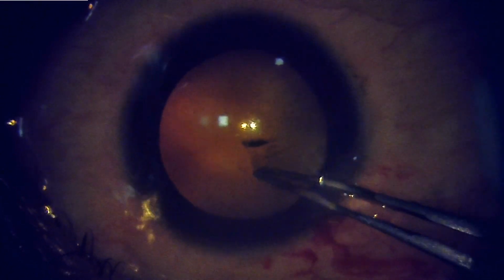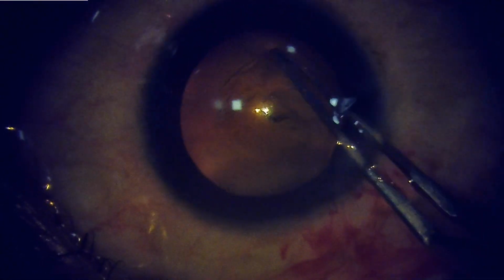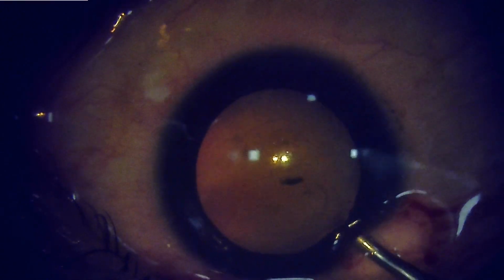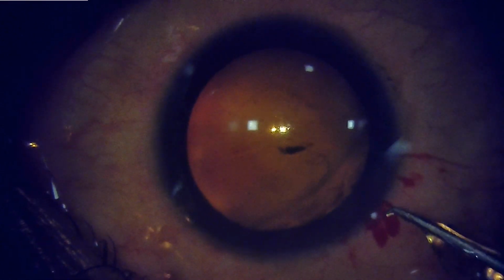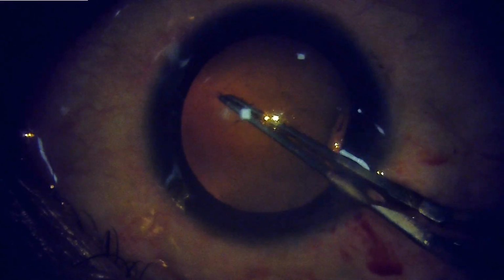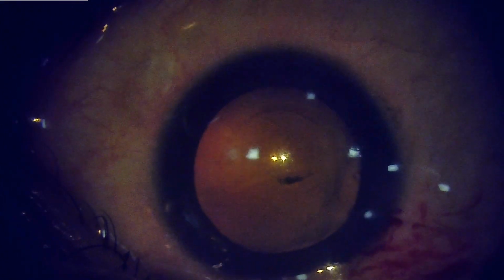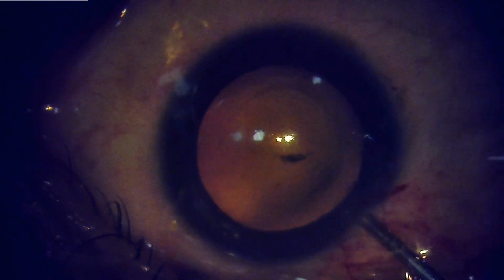Now, usually I do my capsulorhexis in these patients under very, very low illumination with retinal illumination on, because these patients are young and they have so much aversion to bright light, especially the myopes. So it helps in the cooperation of the patient. And that is why you can see the capsulorhexis is being done in very, very dim light. And it's even difficult to see on video.